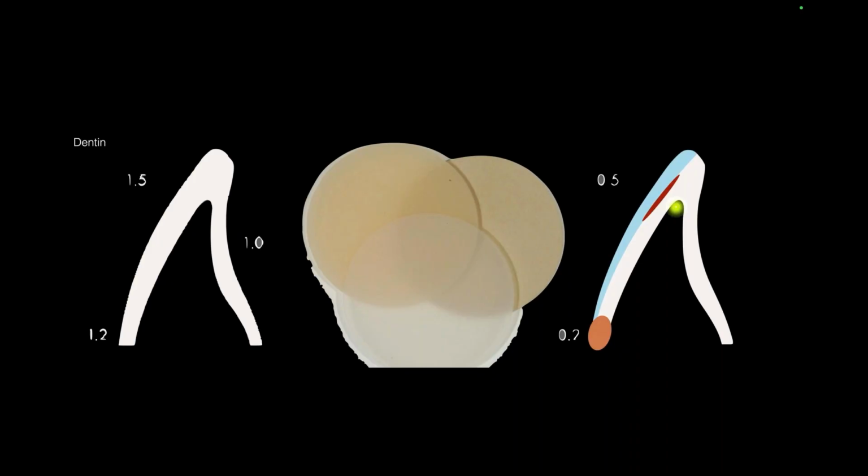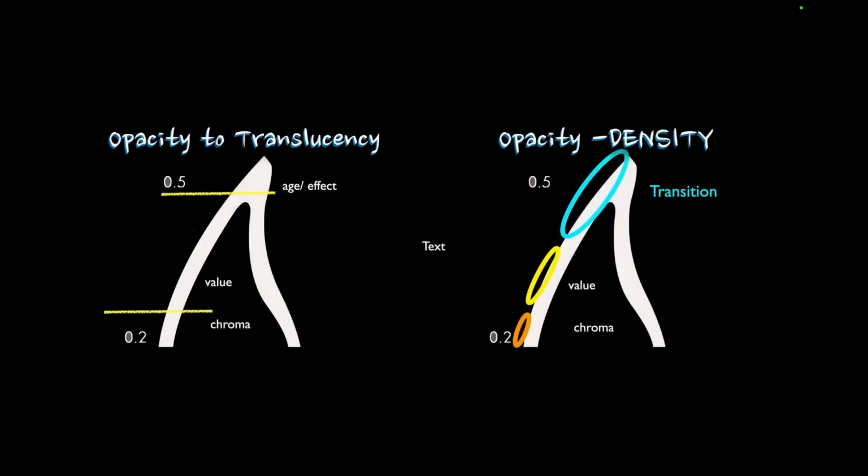But if they do, or if they don't, our really bigger issue is transitioning from where the tooth ends to what I call AIR, which is just air, meaning there's nothing there. And you'll notice that little red patch that I have here, well, that's how I use my Mamelon materials, to hide that transition between opacity and translucency and allow my materials to control it for me. And I try to keep that format whenever I'm going.